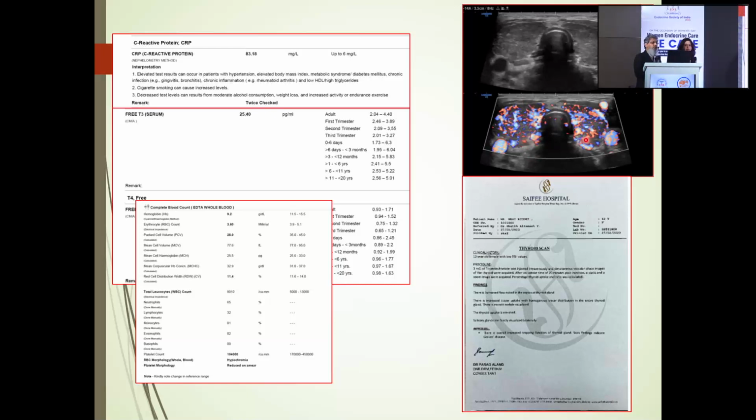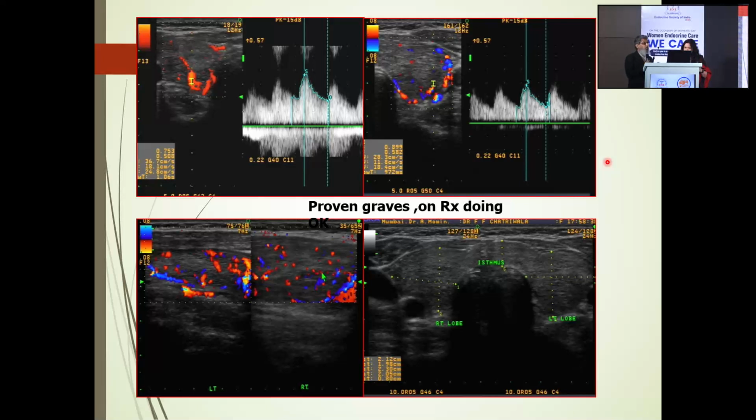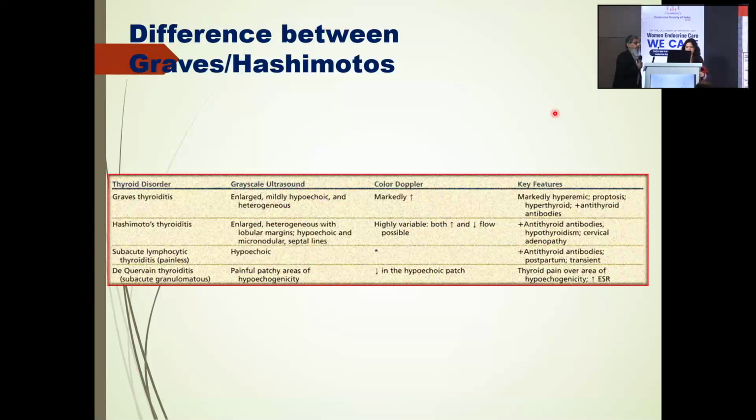The video didn't work here, though I think it's on. And there is the thyroid inferno, which draws your attention. And we use it over a period of time to see whether the thyroiditis is changing its pattern from the high velocity, which ranges above 60 to 70 centimeters per second, taken in the inferior thyroid artery for consistency. Then over a period of time on treatment, if they're doing well, the velocities drop down. So this is one important point. Yeah, that's an interesting thing.